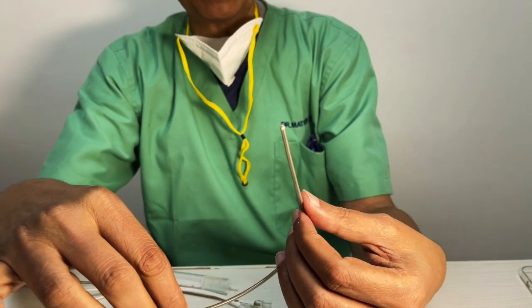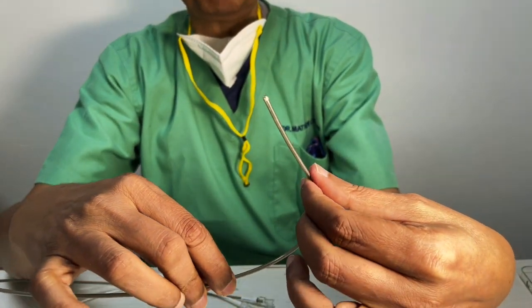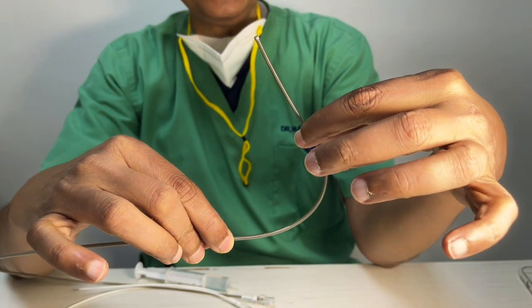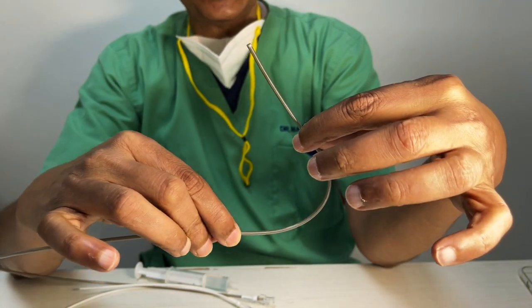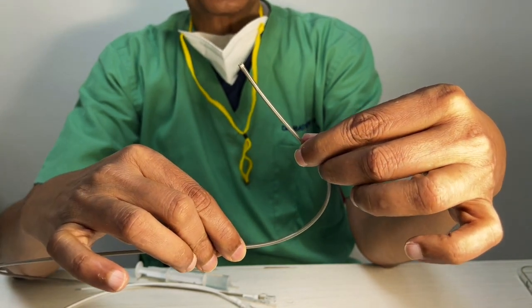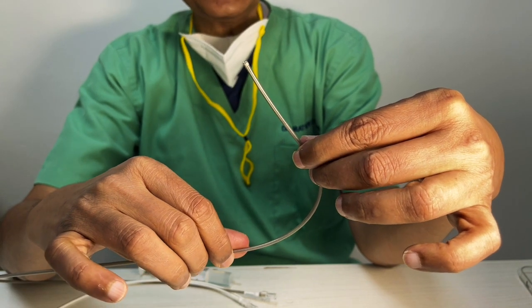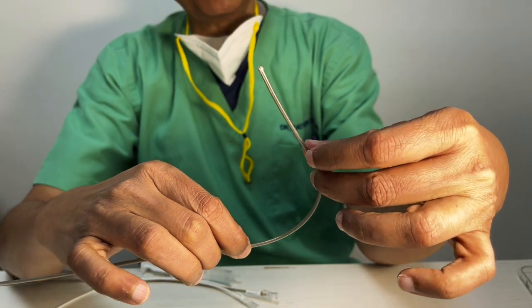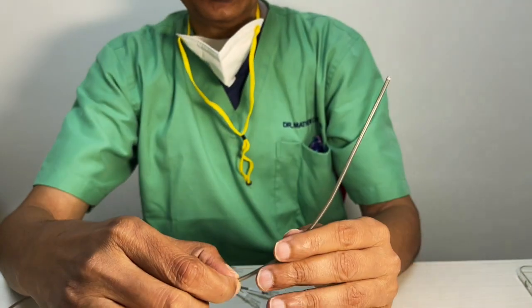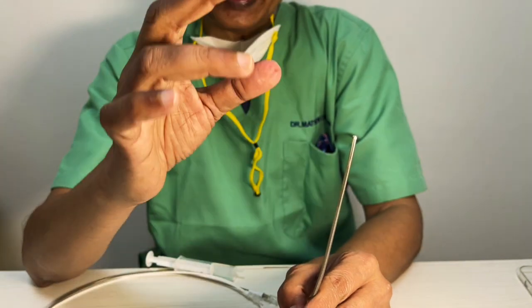So we would recommend this long sheath, I'm sorry. What I meant is that this is made perfectly, if you see, and it gives all the support that you want at the point where the turn takes place from the arch into the carotid artery, and thus you can understand the property of this stiffness versus the softness is what makes a difference.